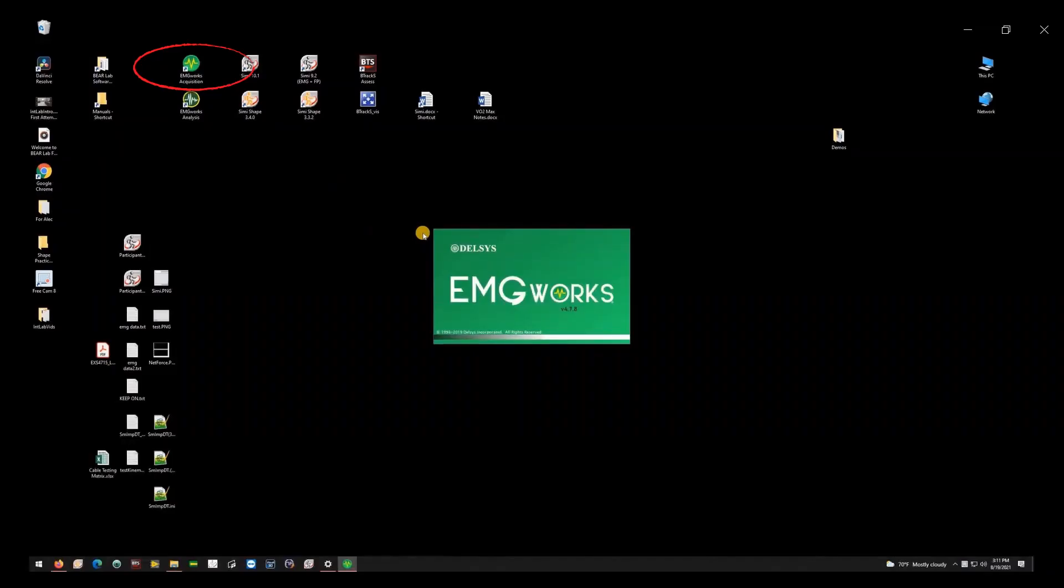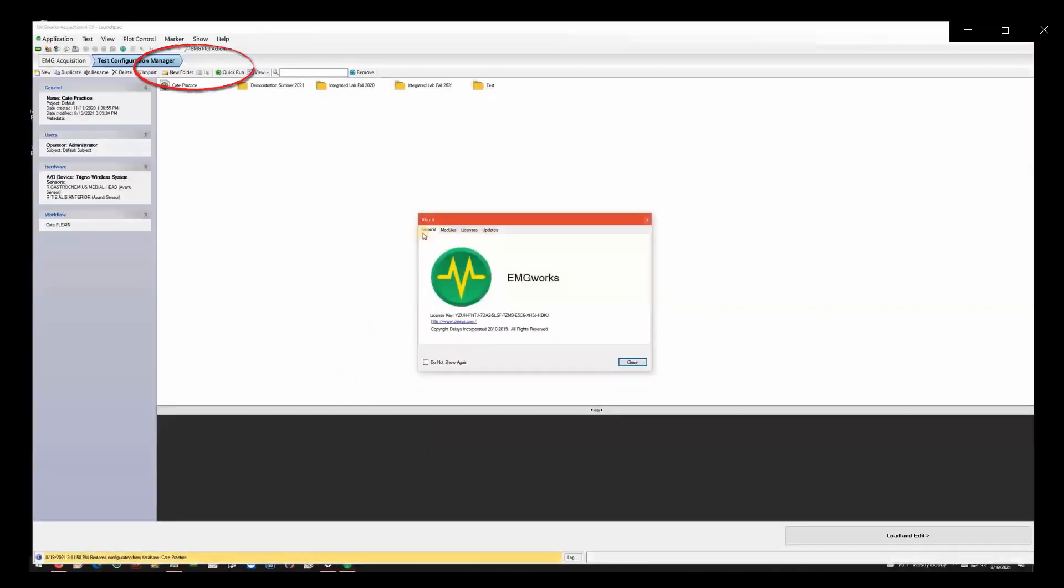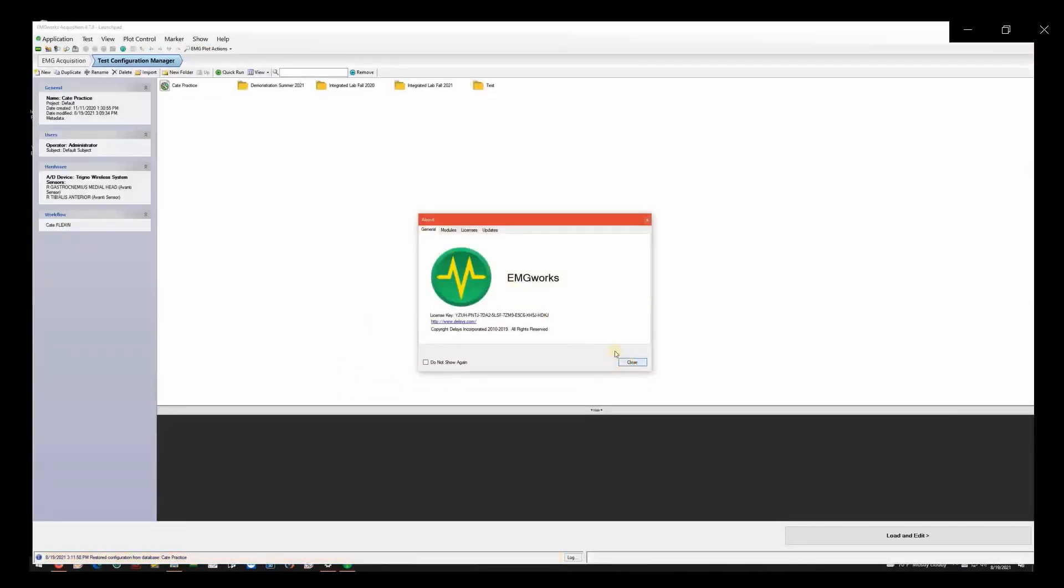To begin, open EMG Works Acquisition from the desktop. Click Close on the About pop-up.